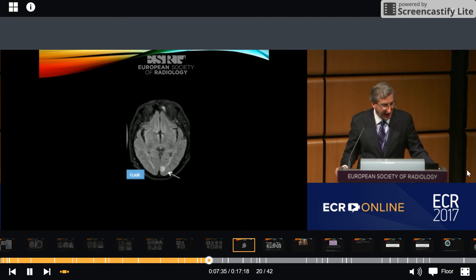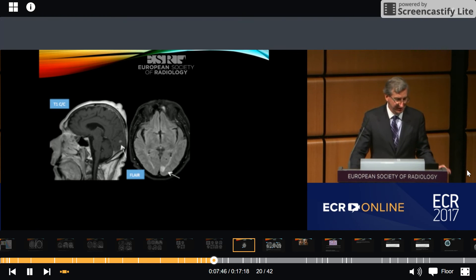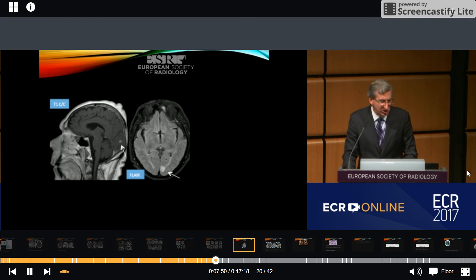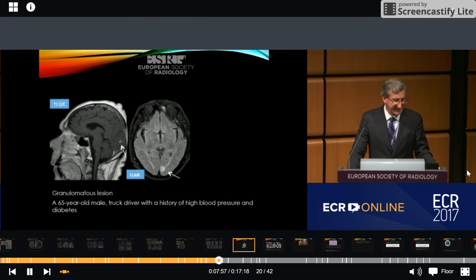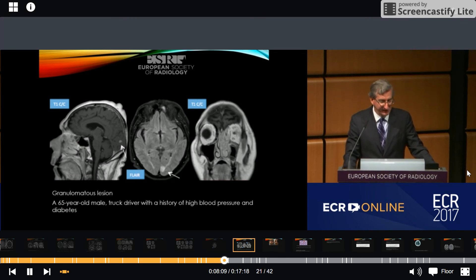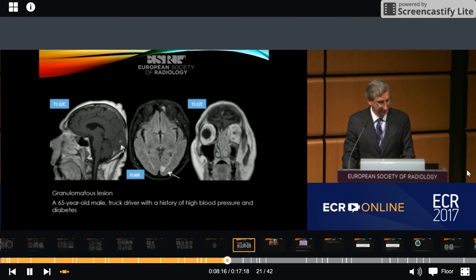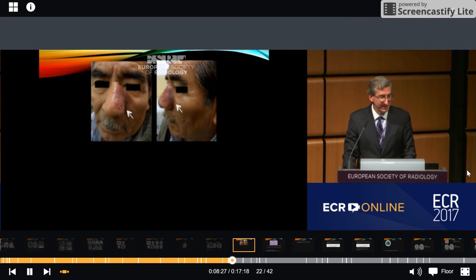Moving on to a different pathology — I show you this FLAIR axial MRI where we can see a focal hyperintense lesion with surrounding edema. After the administration of contrast, we can see enhancement. Without any clinical information, we make the probable diagnosis of a granulomatous lesion. This was a 65-year-old male truck driver with a history of high blood pressure and diabetes. He also presented an enhancing lesion in the left nasal cavity extending to the left orbit. Clinical examination revealed an erythematous elevated lesion located in the left pyramidal area of the nose.